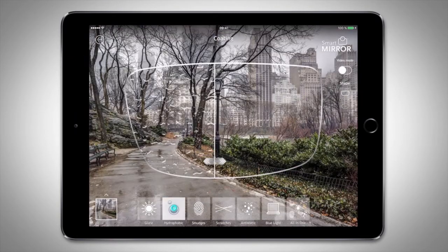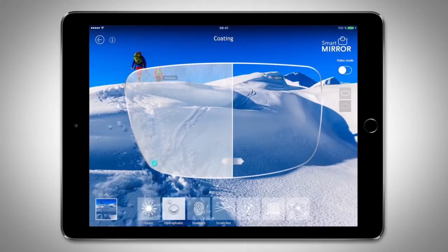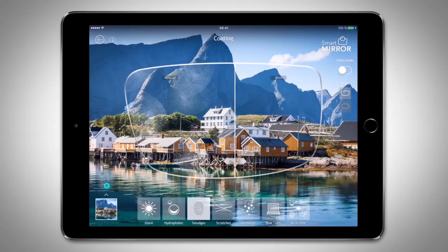The hydrophobic treatment is a rain and water repellent coating that penetrates and seals the microscopic pores of the lens surface with a super slick invisible barrier that helps to repel rain and sweat. It also prevents sleet and snow from sticking to the lens surface on contact by weakening the lens surface tension. This facilitates the aerodynamic runoff of water droplets, which results in improved visibility. The oil repellent, oleophobic surfaces repel water, dust, oil, and dirt on optics. The lens stays cleaner and clearer longer.